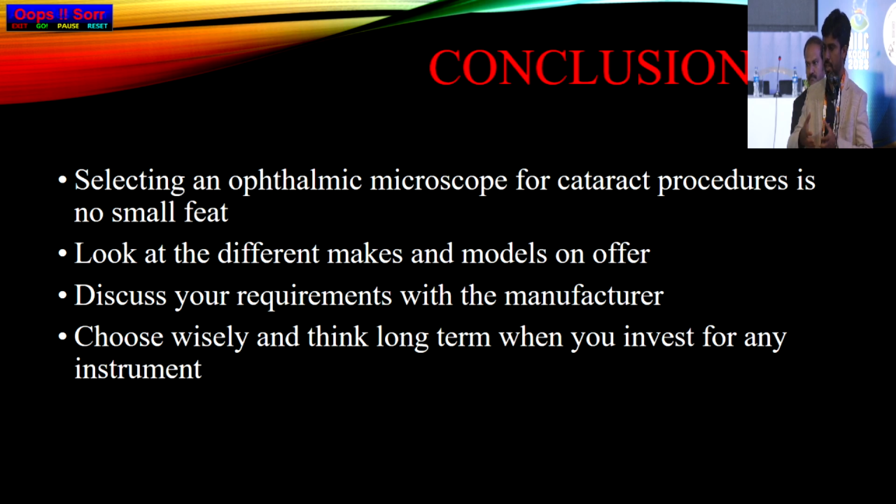Otherwise, for the up, down, and XY movement, there is a lot of load because of that extra gadget and the recording system which is attached. So I call them once every 6 months, and it all depends on how you use saline. Sometimes when the assistant pushes it, that is where the issues come. So I tell them not to put saline. I use only visco.